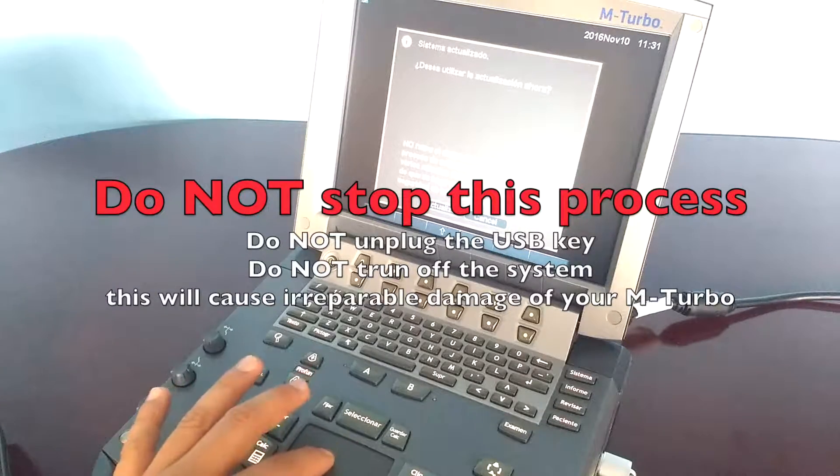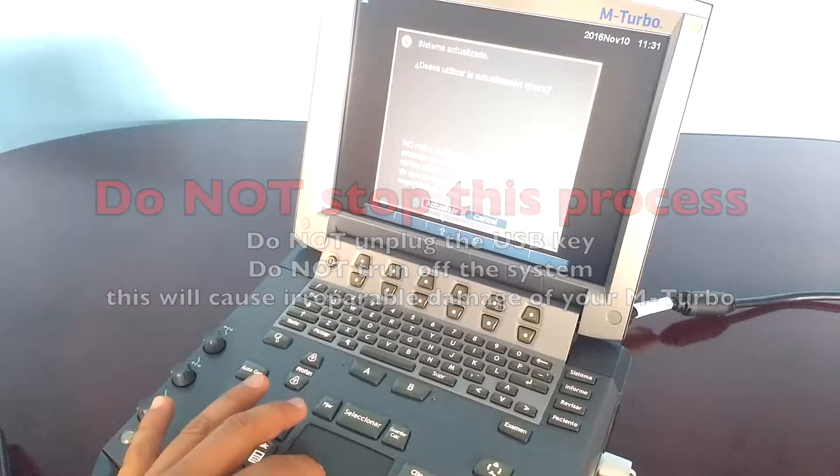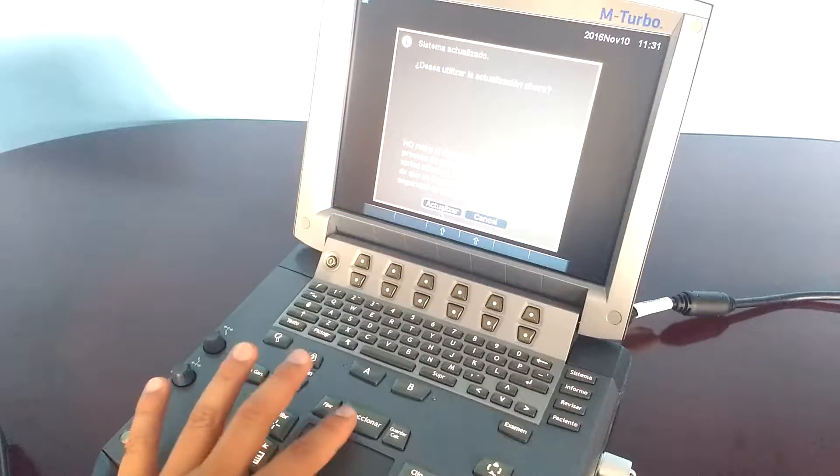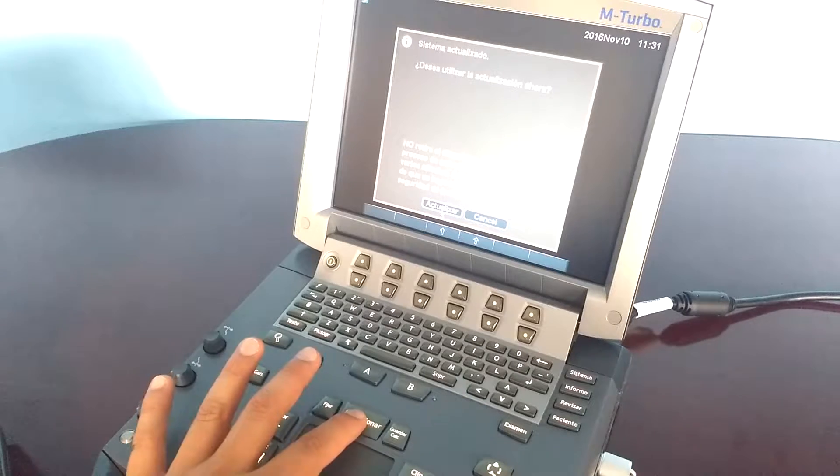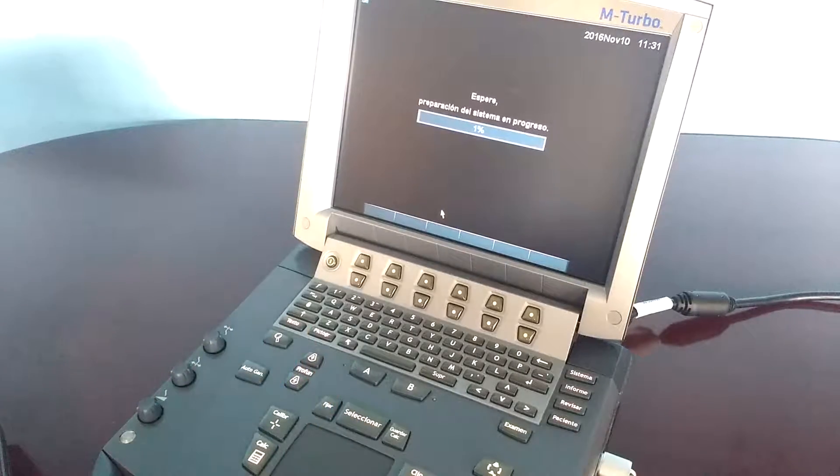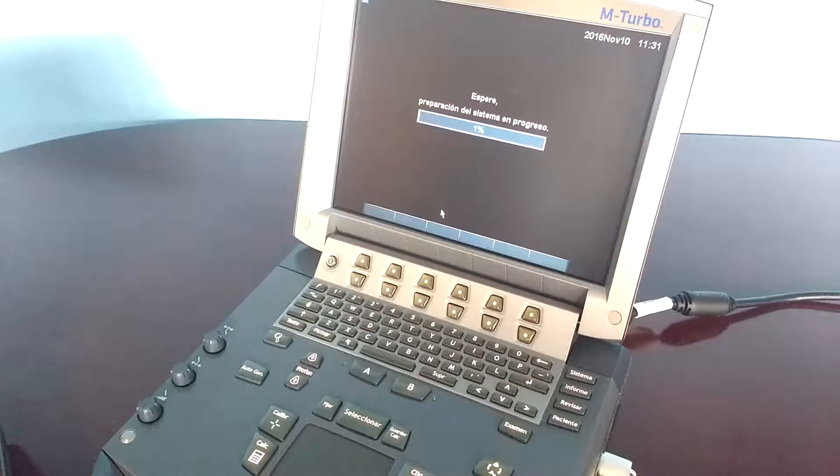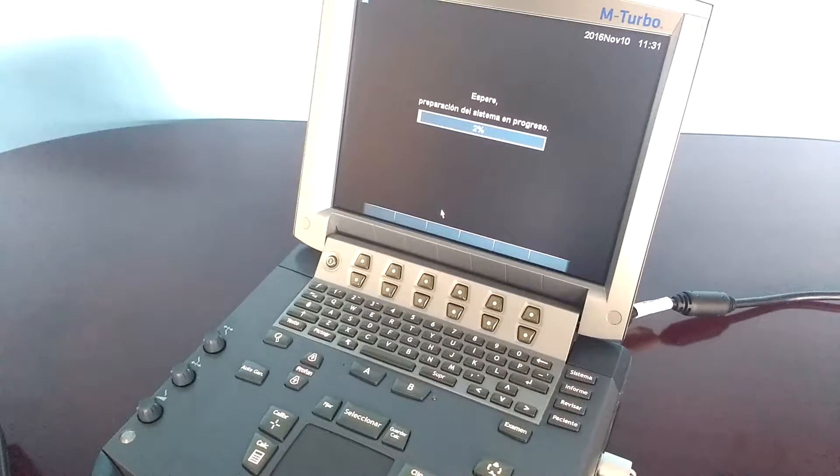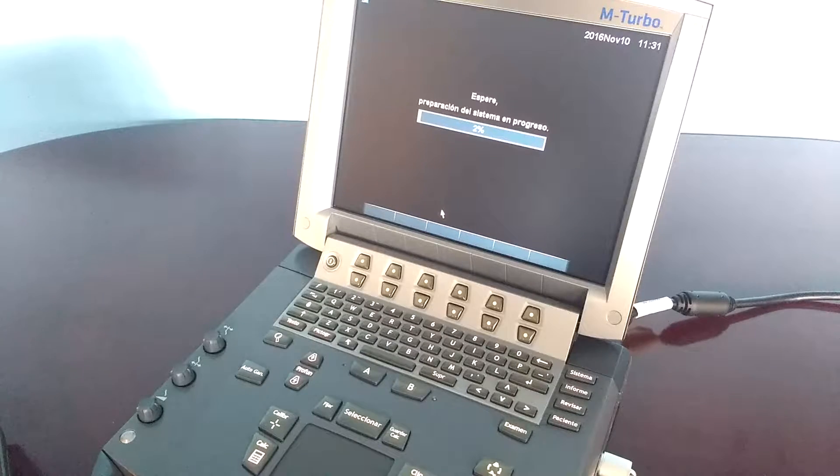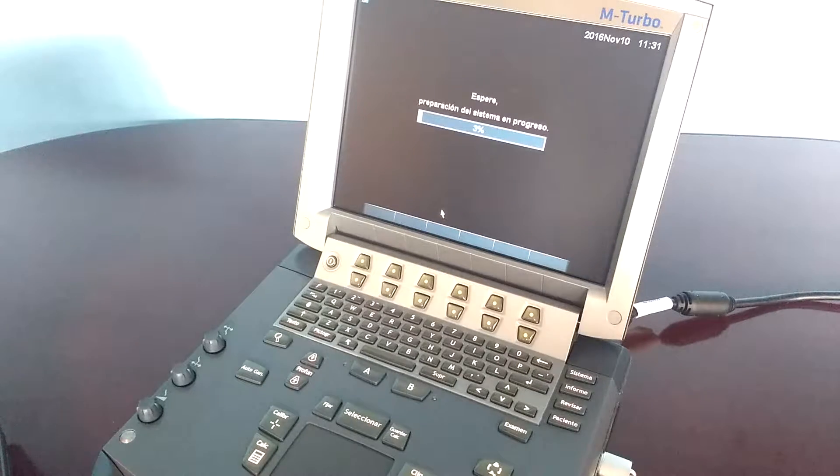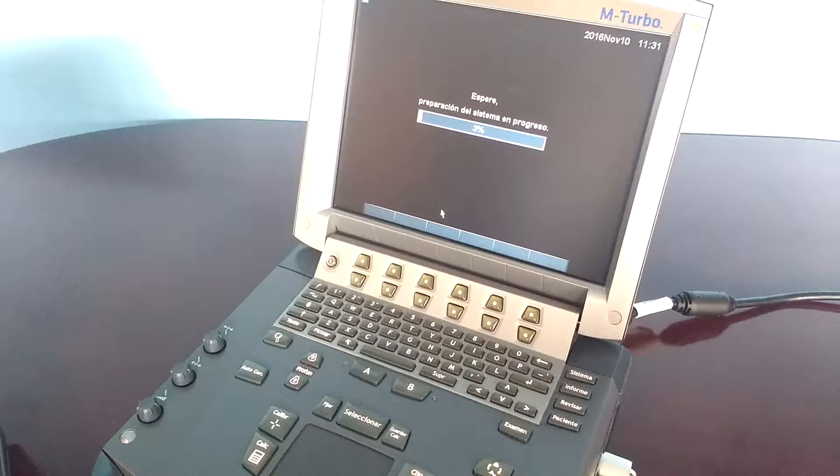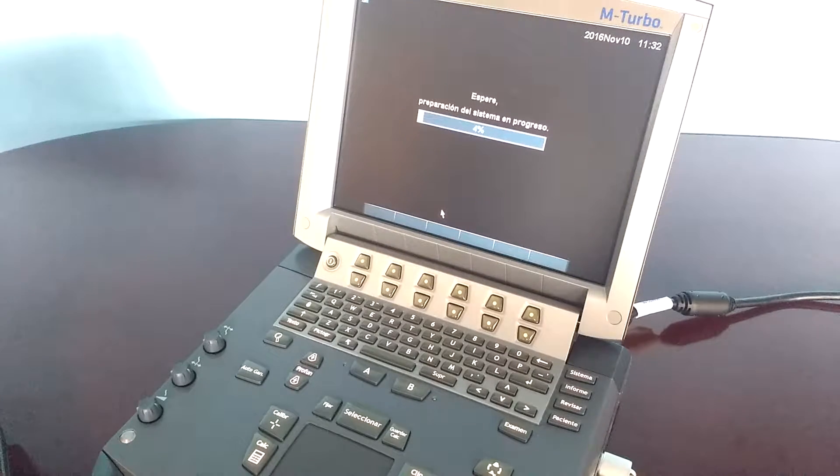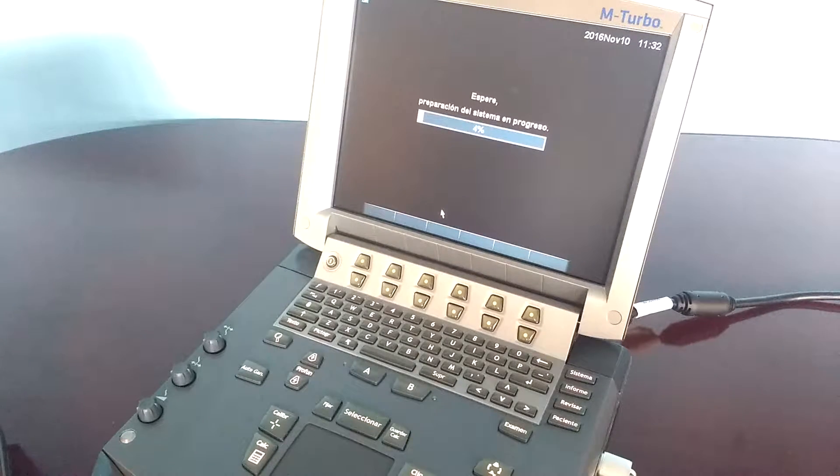Click on upgrade to begin the upgrade. This will take several minutes. Please be patient and do not stop the process.